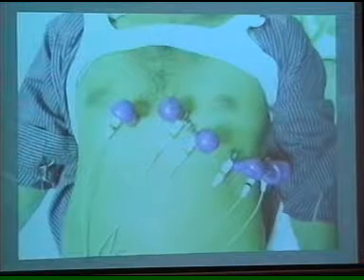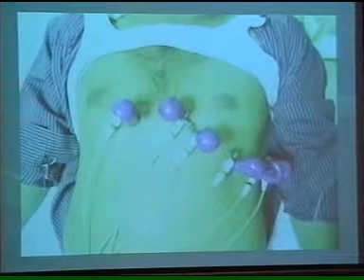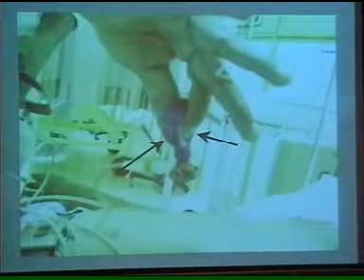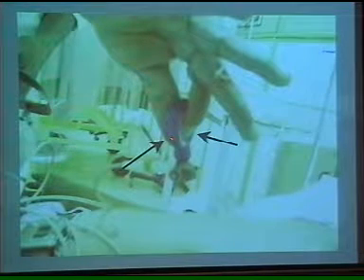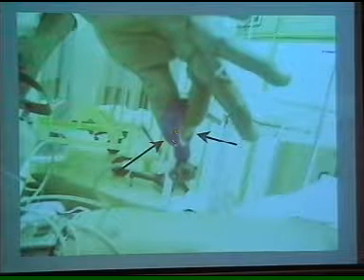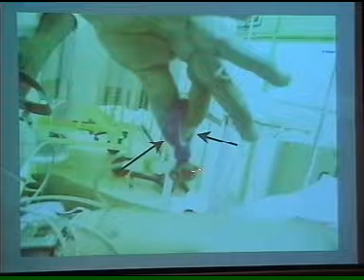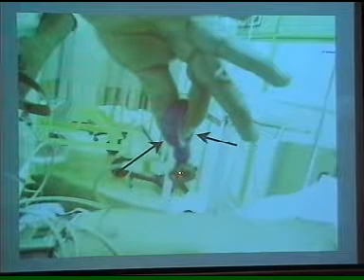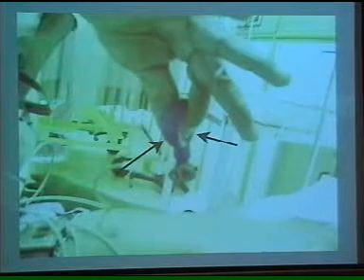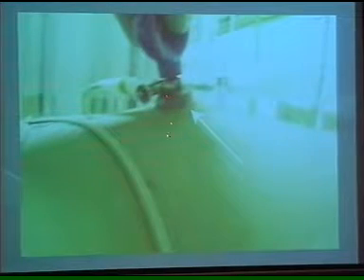So from the top it looks like something like this. So how to put these leads? Usually there may be leads which stick on the skin, but usually with a rubber bulb which creates negative pressure, and there is the bell which attaches to the skin. You start by pushing it, making a vacuum, then attaching to the skin and leave it, and you check. It is a negative pressure, it actually sucks the skin.